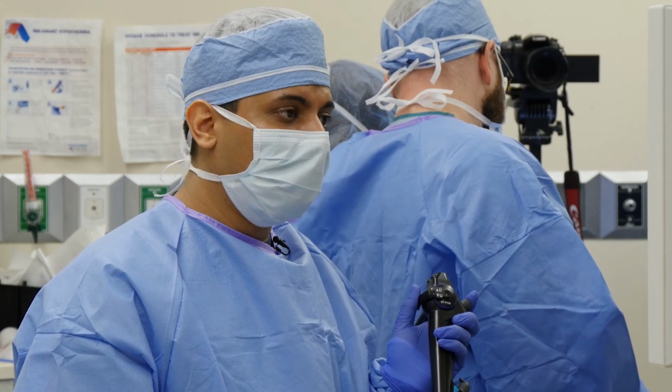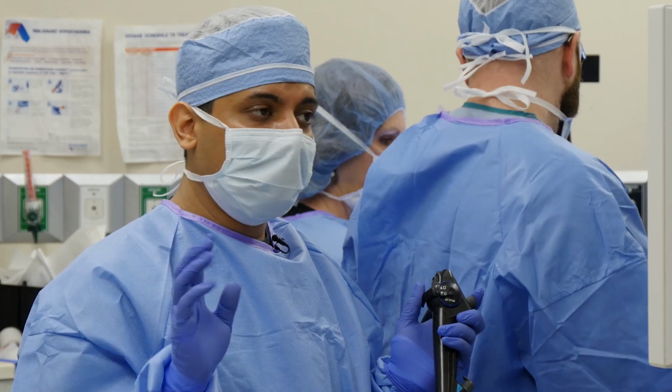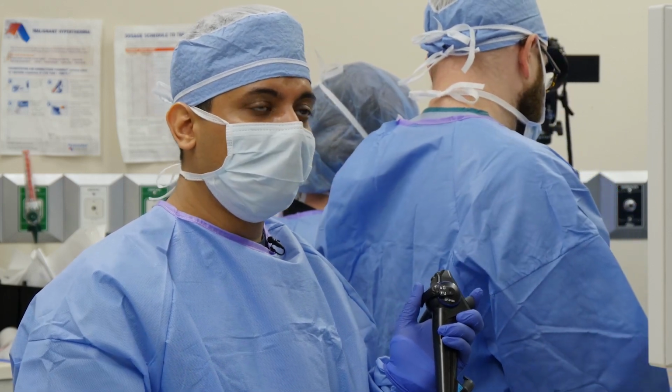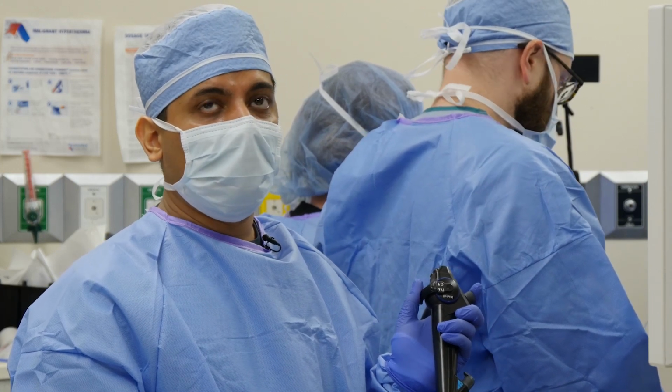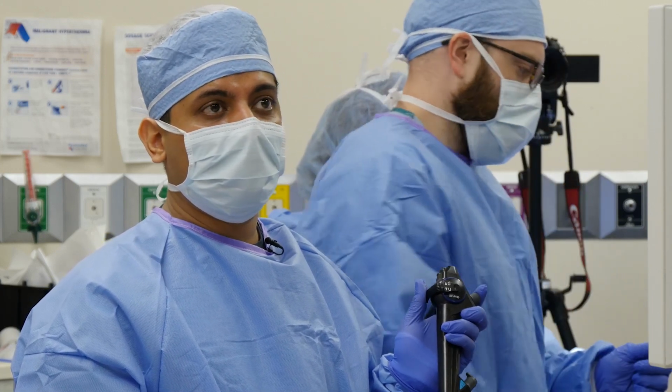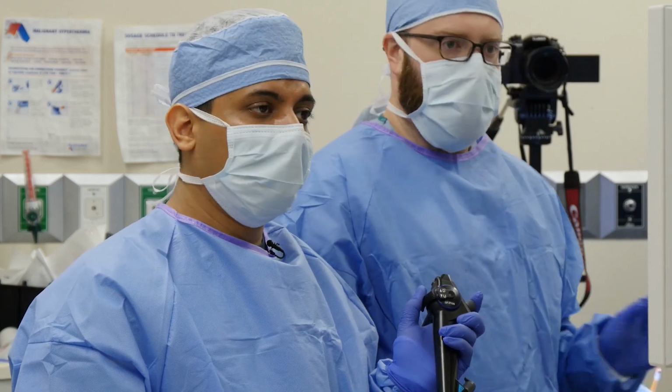He's already seen our thoracic surgeon. So at this point, I'm going to get some more samples, and then we'll go ahead and put fiducial markers in. Those markers help the radiation oncologist to plan stereotactic radiation, which will be the treatment of choice here.